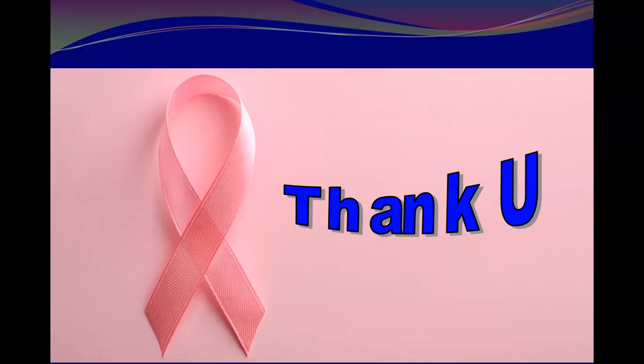I'll ask Hind, Suhair, or Medina. Are you there? Yes. Okay. How can we eliminate artifacts, even including posterior enhancement and posterior shadowing? Compound imaging. Excellent, well done.